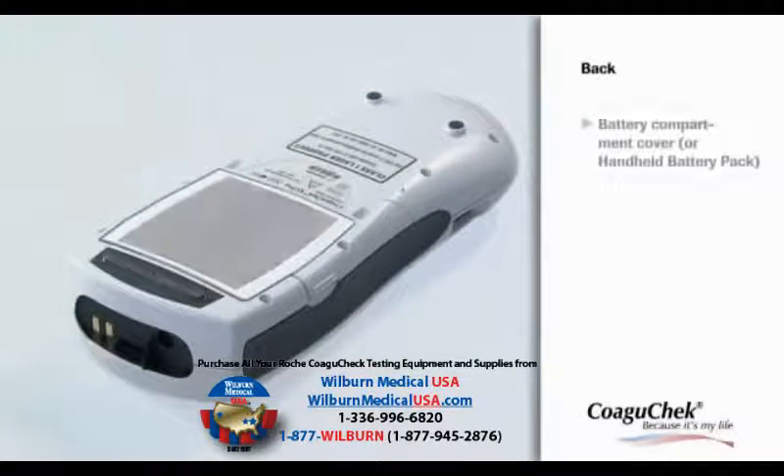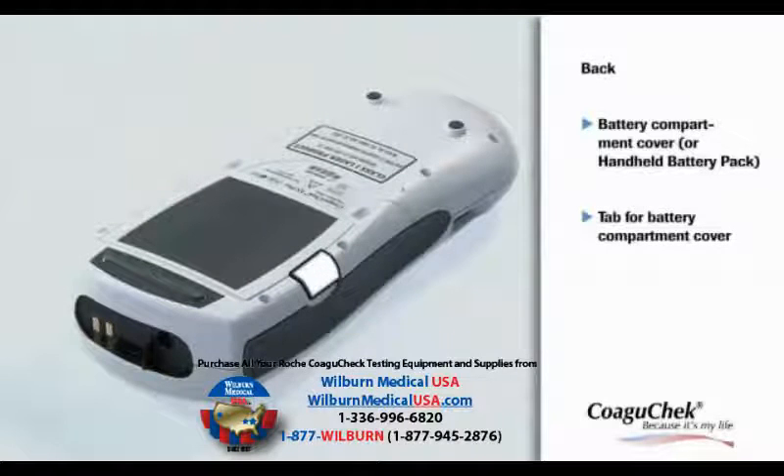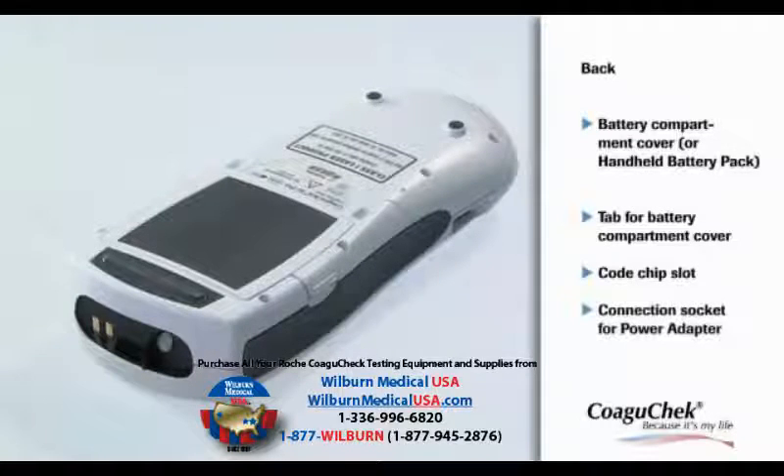At the back of the meter, you will find the battery compartment cover and a tab to lift the cover. The code chip slot is on the top of the meter — this is where the code chip has to be inserted. In the connection socket, you can plug in the power adapter.